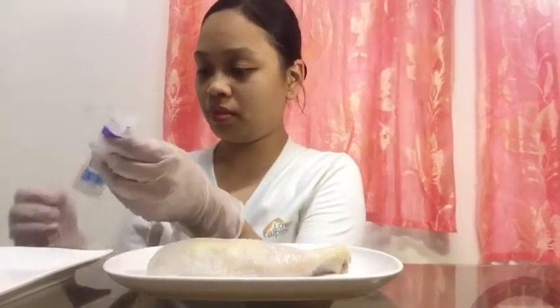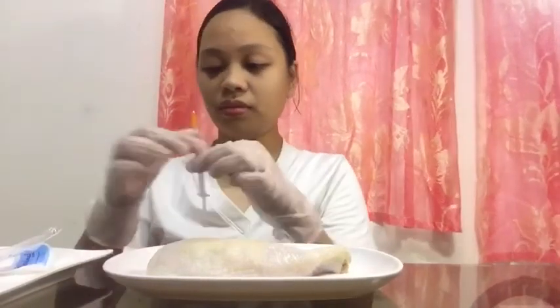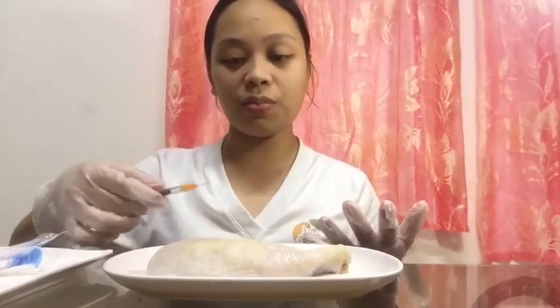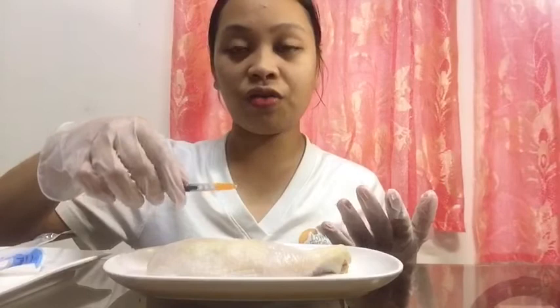And then I'm going to prepare my injection. And then I am going to inject the fluid into the patient, the bevel facing me, at a 5 to 15 degree angle.